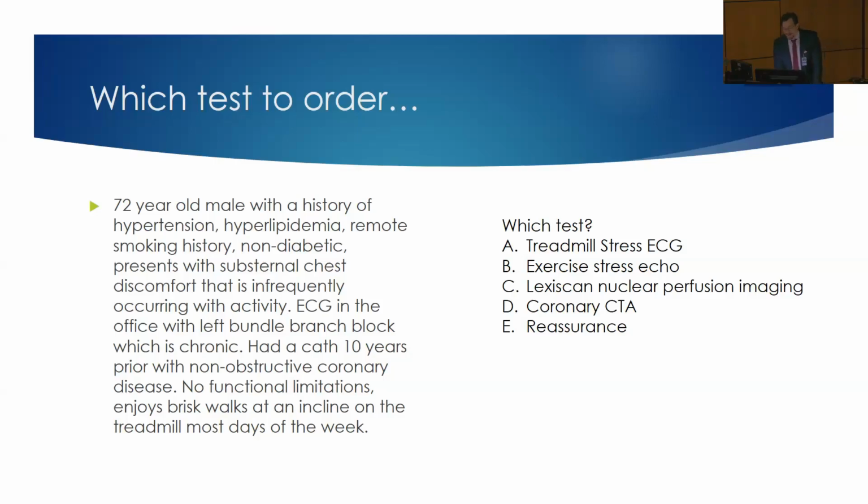So you're close. No coronary CT because the patient's last cath already showed a bunch of plaque. He's above the age of 65. And I'd just be concerned that if we start with a coronary CT, it might overestimate the presence of plaque because of all the calcium that's there, and so that might lead to an unnecessary heart cath. So the right answer would be an exercise stress echo to start.